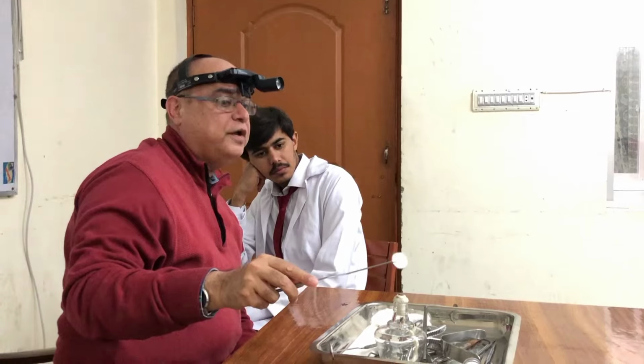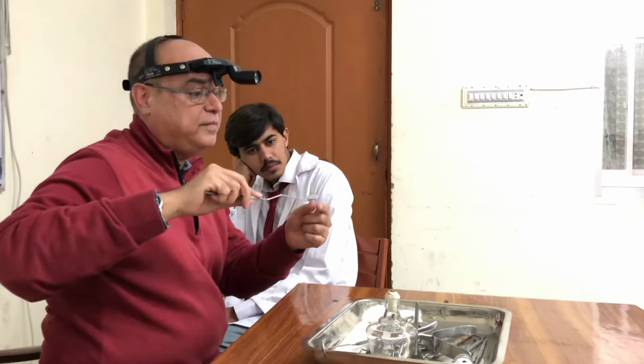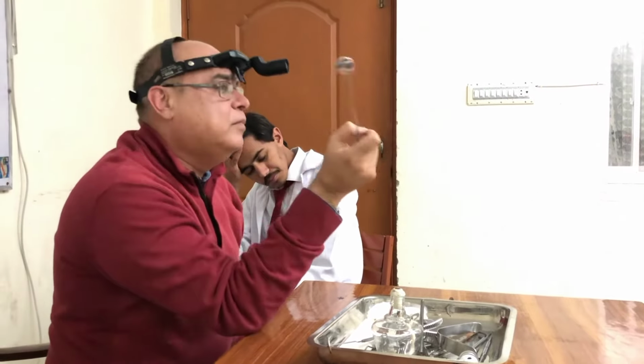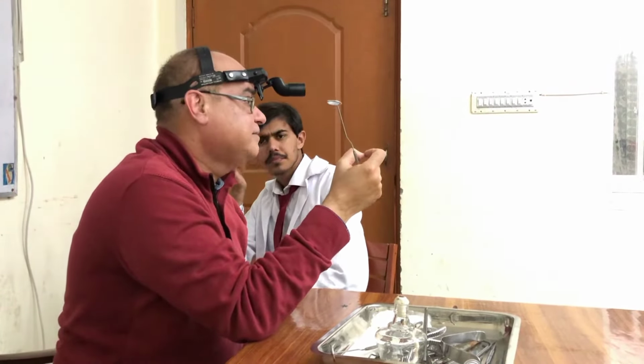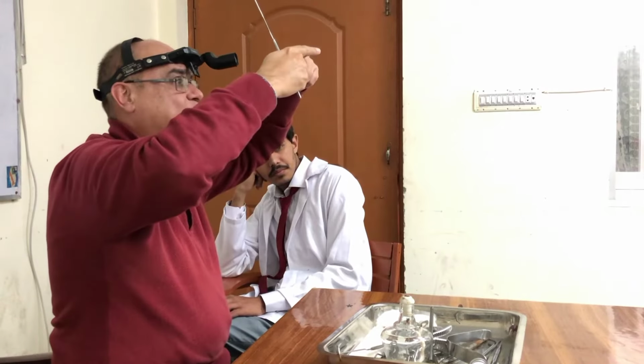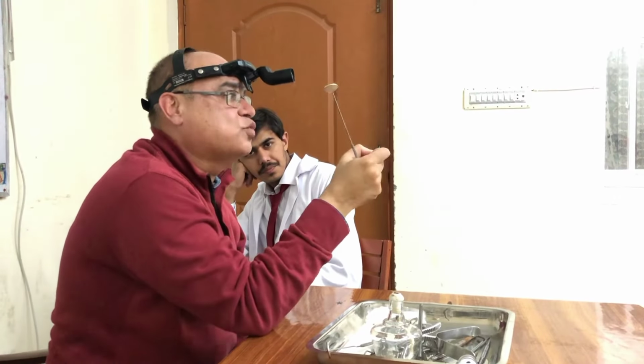You will warm it from the mirror side, not from this metallic side, because if you warm it from the metallic side, it will dilate and the mirror may fall down. And in the flame, you know that the flame has different parts. Which part of the flame is the hottest one? You know, in the center there is blue, then outside is yellow, then outside is one invisible portion, from your physics knowledge. Which part is the hottest one? No, the outer invisible part is the hottest one.